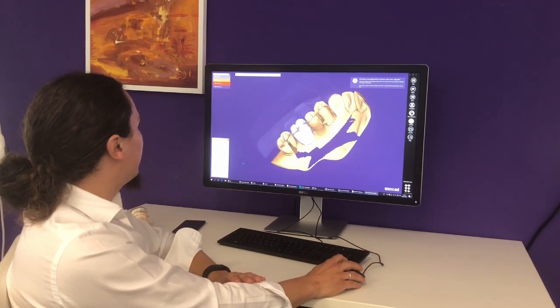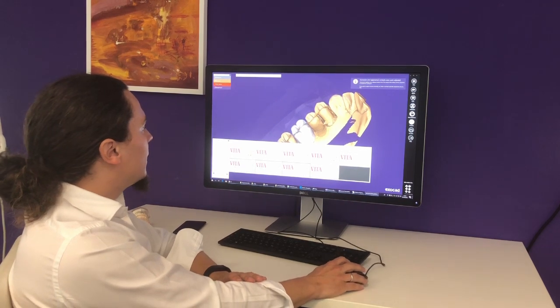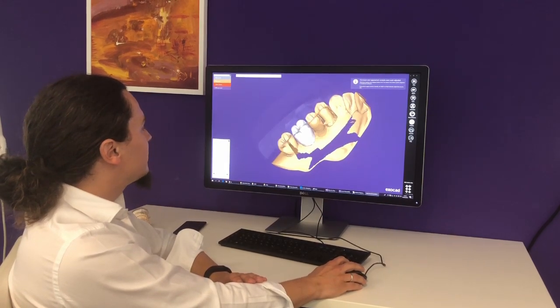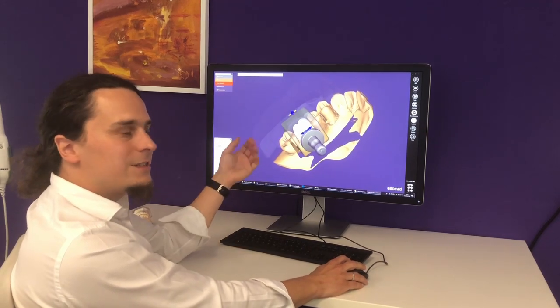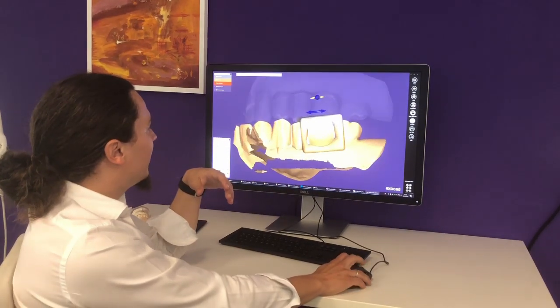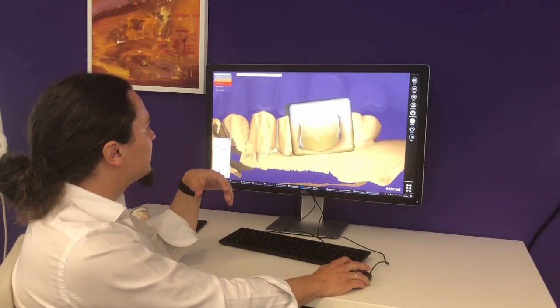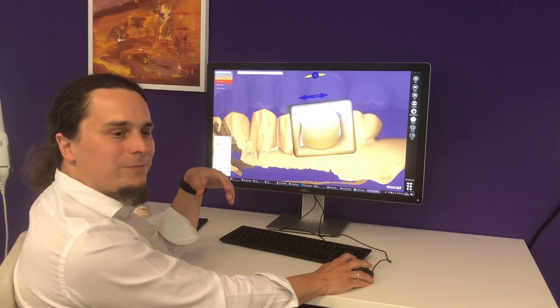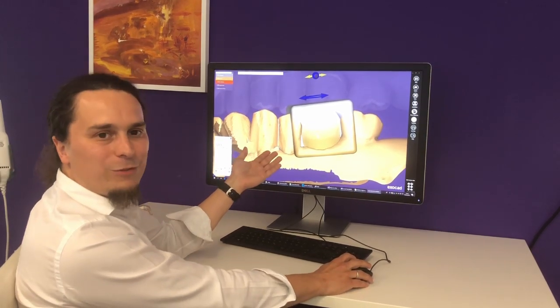I choose the Evita Trilux blank so that you can also see the nice visualization of the multi-shaded blank. Again I can adjust the suggested blank placement to have full control over the shading. This case is now ready for production.